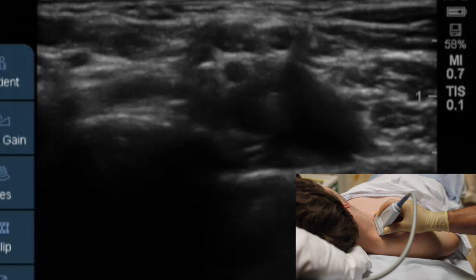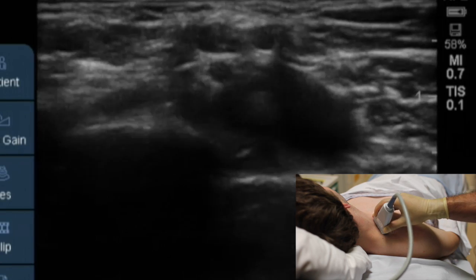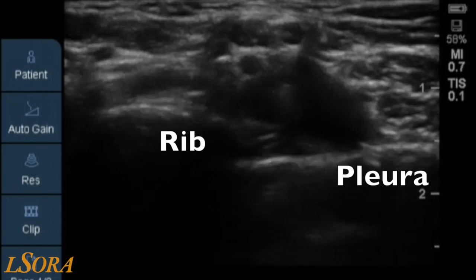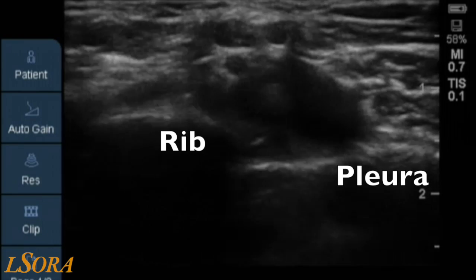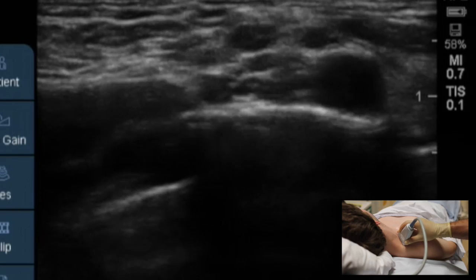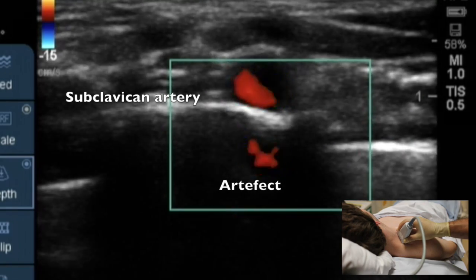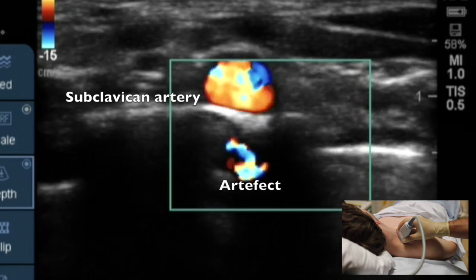Here we are demonstrating the effect of probe tilting on the position of the subclavian artery in the plexus. Changing the tilt can alter the position such that the brachial plexus and the artery are lying on the pleura, a non-ideal place to block. Here we can clearly see the first rib with a bright white line and the acoustic dropout below it, with the pleura line to the left and right of the first rib.